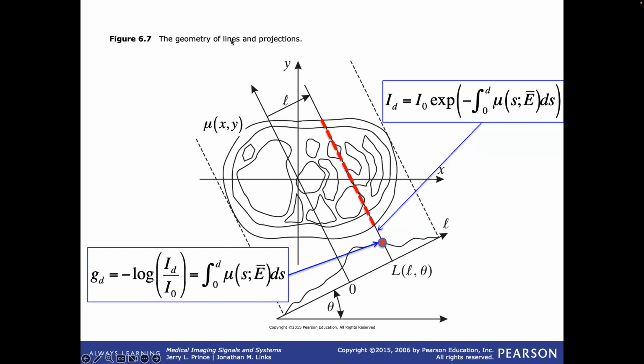We're assuming mathematically what we're going to look at are the parallel rays, right? And so one way of saying, well, how could that happen, is I have a source that shoots X-rays down this way, and then I raster that source across the sample. And that's how CT imaging was originally done.